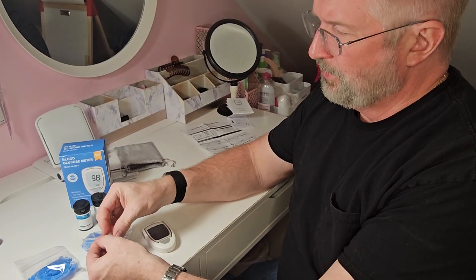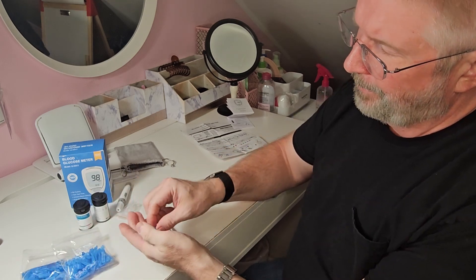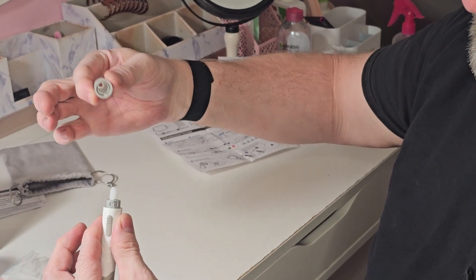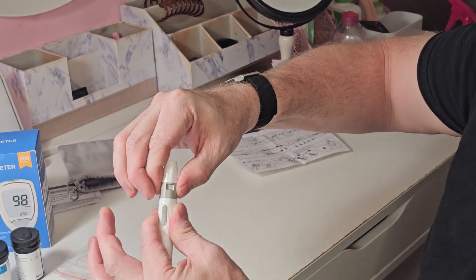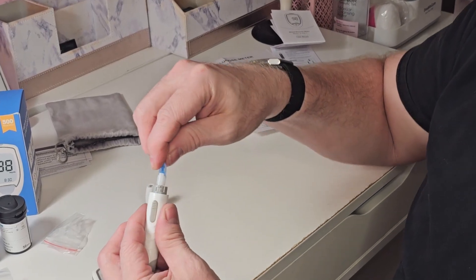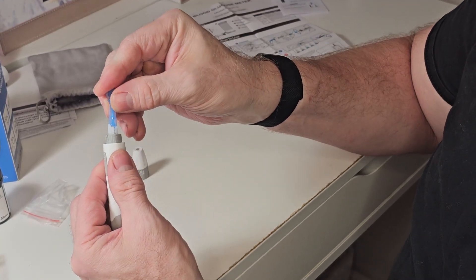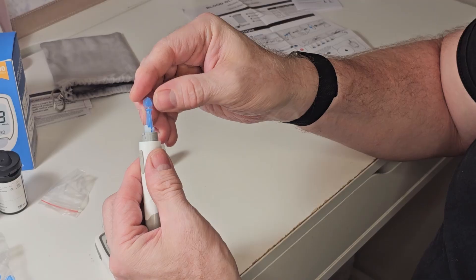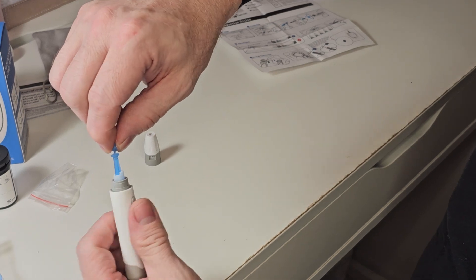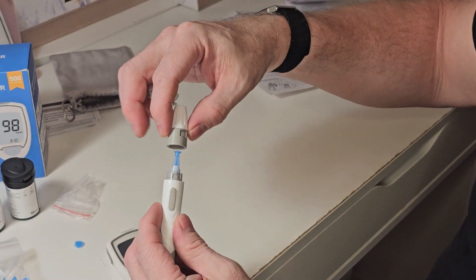These are your lancets and you get a bunch of them. Twist the lancet device open, put the lancet in at a slight angle, and then twist to close. It was a little tricky to figure out at first — it goes kind of down on the side. Push it down so it's loaded, then twist the top open.